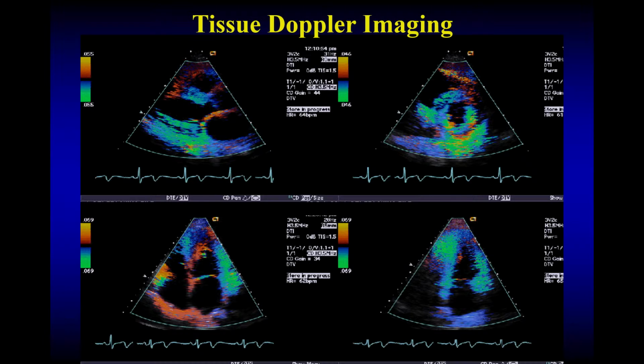And that filter is not too hard to do. The reason for it is that the Doppler shift obtained from the myocardium is much stronger, because of the density of the myocardium, and much lower velocity, as opposed to a softer and higher velocity signal, and that's why you could differentiate that.